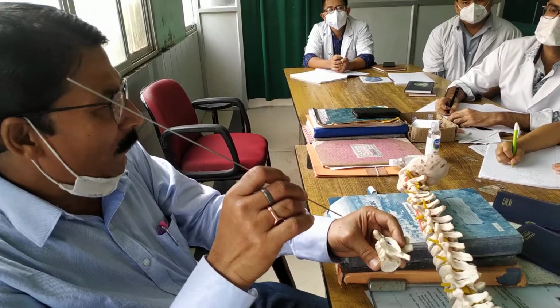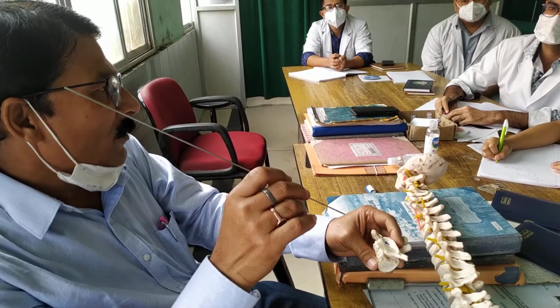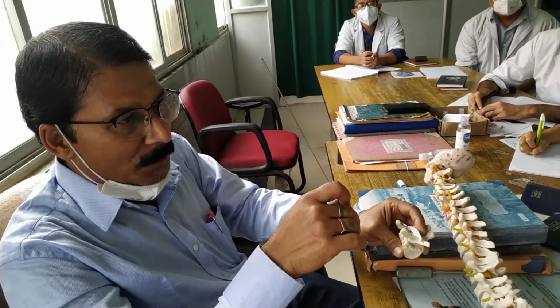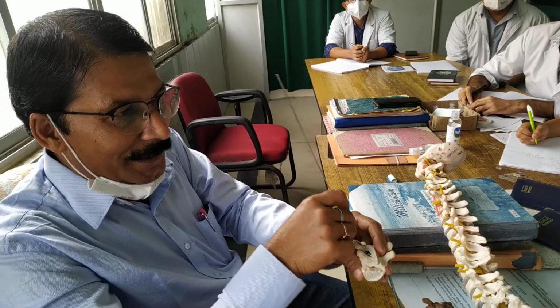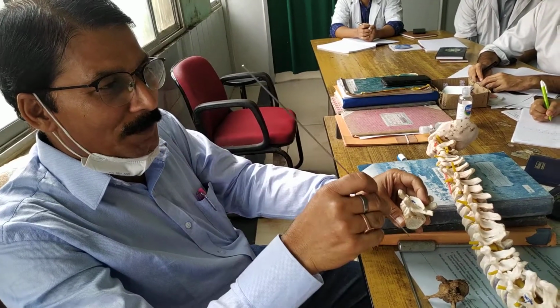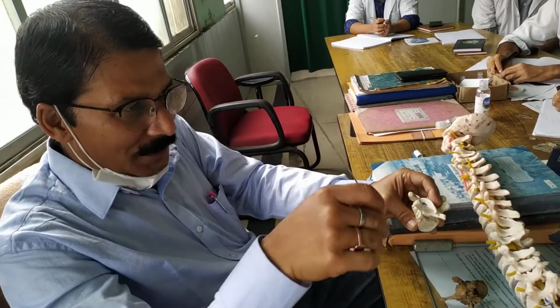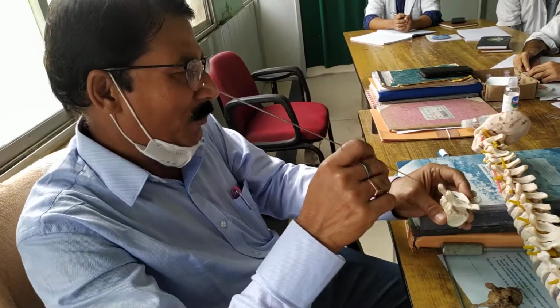So we have to be careful that I do not want any soft feeling here. A soft feeling means you are violating the wall. You must have 5 walls, so to say: superior, inferior, medial, lateral, and distal, so that you do not go beyond the body of the vertebra. Soft feeling is dangerous, do not go for a soft feeling. It is always a gritty, hard, bony feeling all throughout the course.